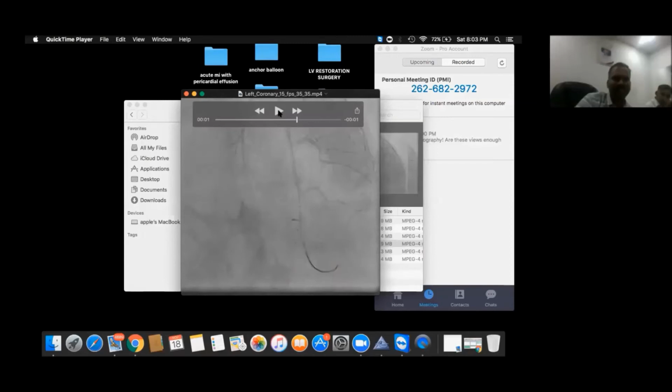It's diffusely diseased, and we did an IVUS. IVUS clearly showed disease everywhere. These are the cases where you can use IVUS to decide where you can end your stenting. So clearly there is a diffuse disease and clearly there is a negative remodeling of the vessel. So this is not a right case. If you send this patient to bypass, nothing may happen, but this bypass graft to the LAD may not work. So that is the issue.